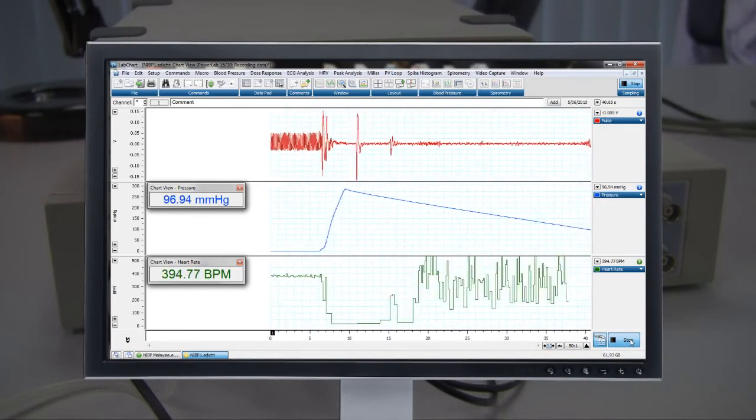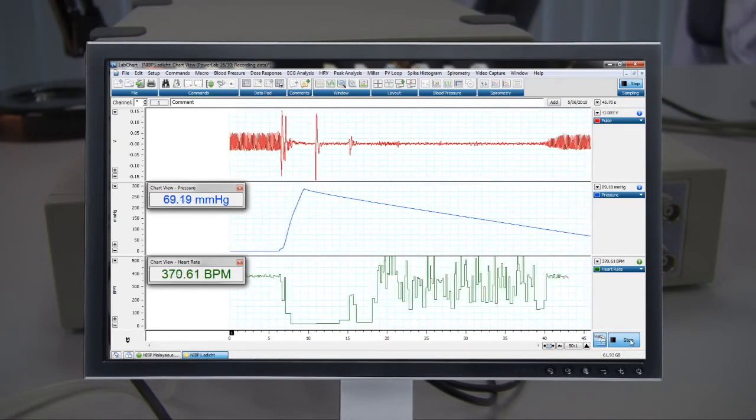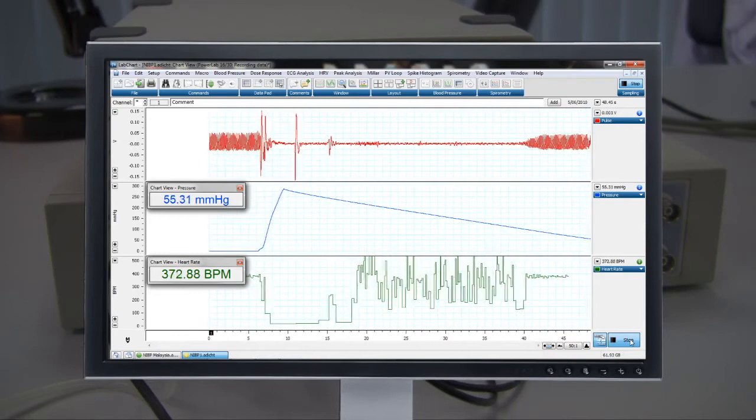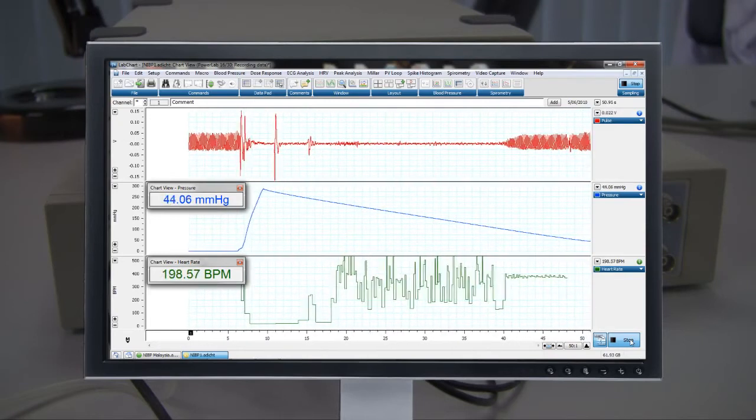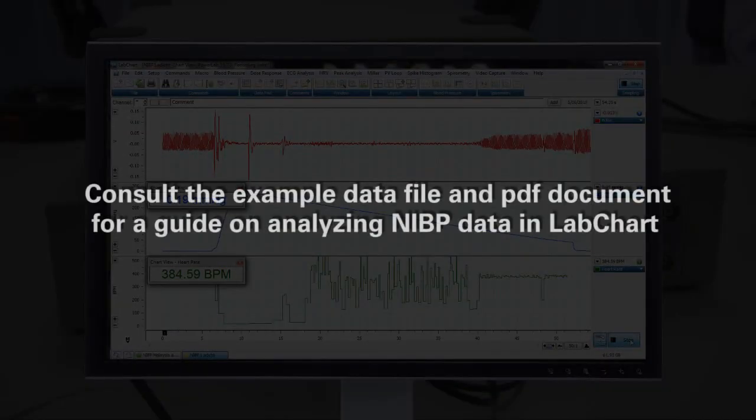As the pressure drops, the pulse signal will start to increase again. Consult the associated example data file and PDF document for a step-by-step guide to estimating actual systolic pressure and the derivation of diastolic pressure from data recorded in LabChart with the NIBP system.